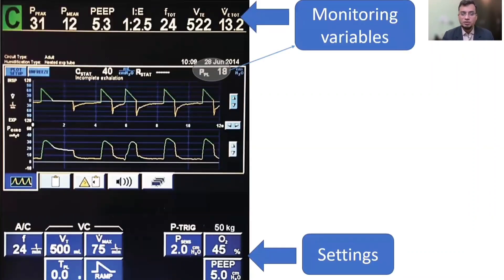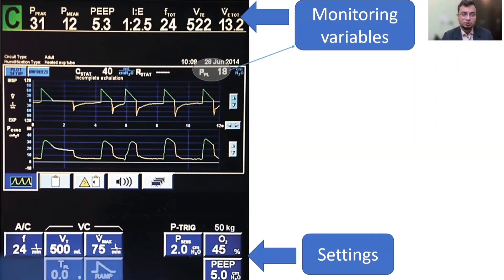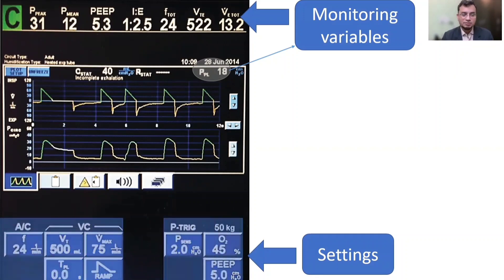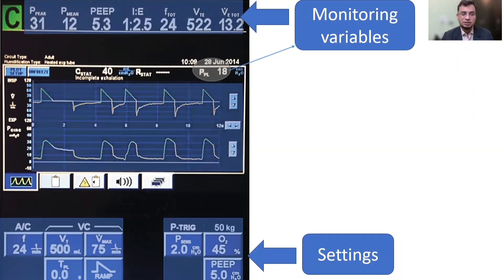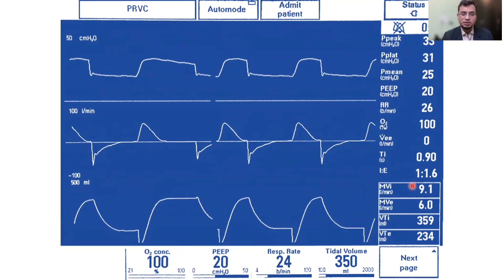This is a screenshot of a mechanical ventilator — the Puritan-Bennett 840 screen — showing various settings and monitoring variables. The setting variables are shown alongside monitoring variables in the upper part of the screen, along with graphs. This is also a screenshot of a MAQUET ventilator, where you can see graphs and numbers including monitoring variables such as peak inspiratory pressure and plateau pressure, which will be discussed in the next module of this tutorial.